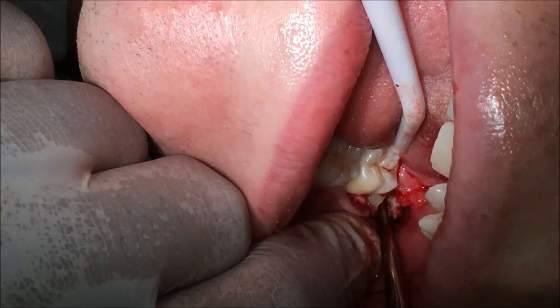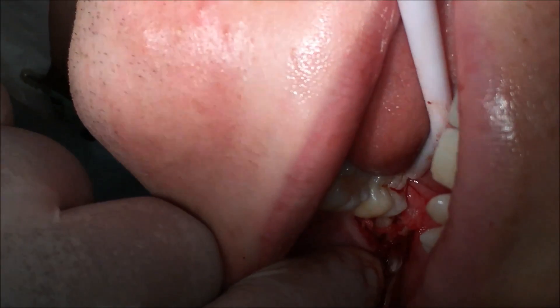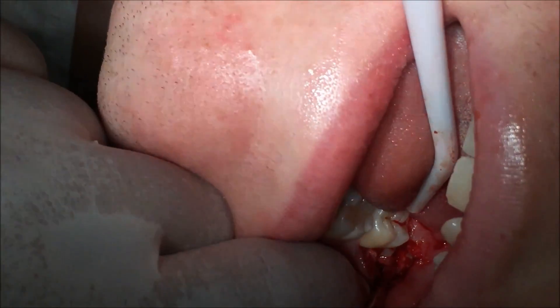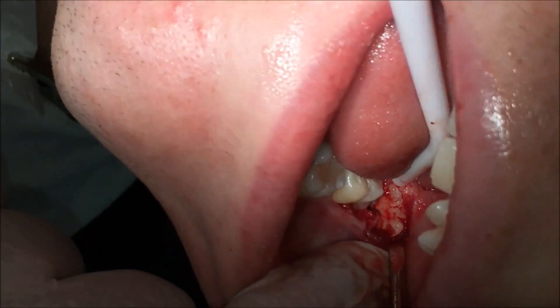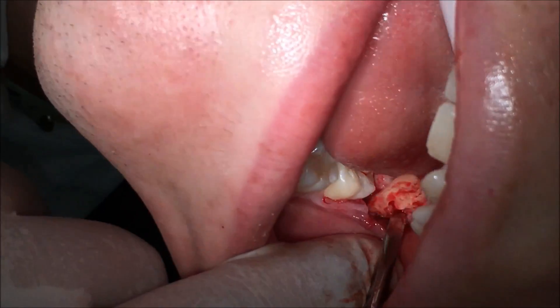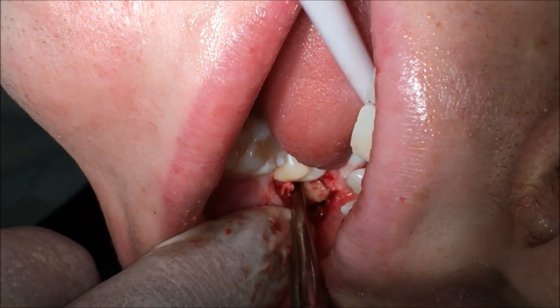As I go to split these roots, they're still fairly well moving as one complex, and it eventually splits the distal — that's fairly quick actually. Just an elevation force on the mesial of that distal root brings it up, and we just deliver it with some diamond-tipped forceps. This will just deliver with my luxator — into the furcation area in the pulp chamber. The mesial root is just a formality once that distal root is gone.